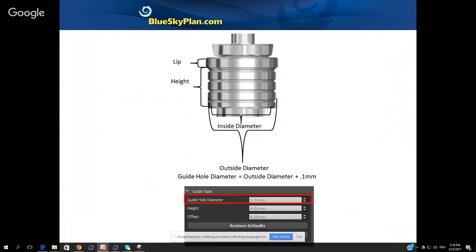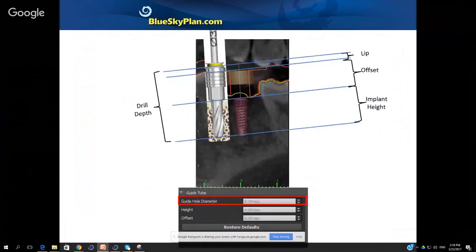The height of the metal cylinder is the portion that goes into the printed surgical guide. So the second field in the software under guide hole diameter says 'height' — you set that to be the height of the metal cylinder that goes into the printed surgical guide. On top of that we have a lip which protrudes and sits on top of the printed surgical guide. The offset is the measurement from the top of the implant to the top of the printed surgical guide.